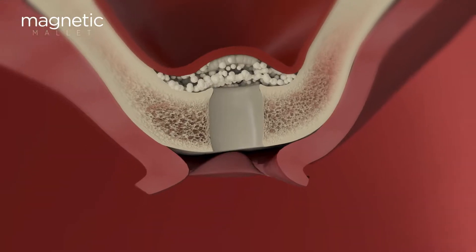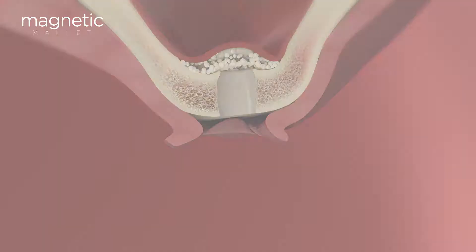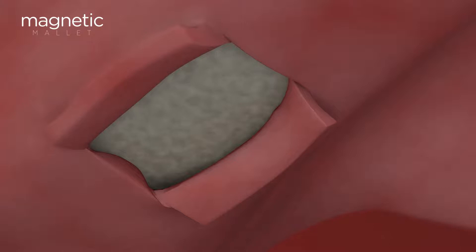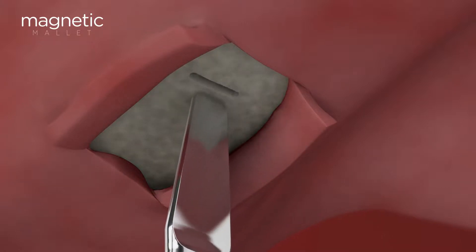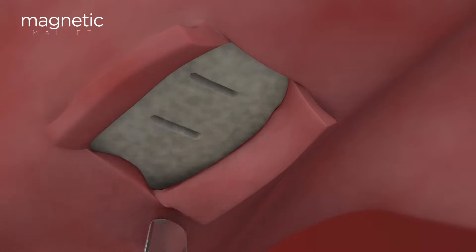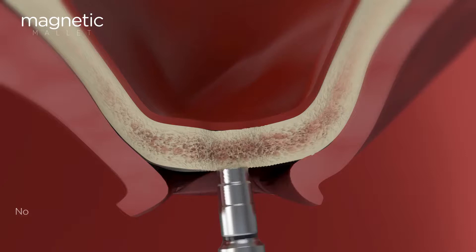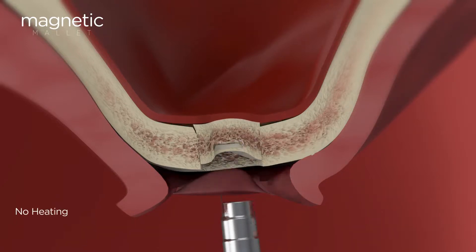The magnetic mallet will allow you to perform precise plastic deformation of the tissues, elevating the membrane with total control and safety, and protecting 100% of the native bone. If you have very limited residual bone, you'll be able to create a bone block and progressively elevate the membrane using the same level of control and safety. You'll experience no risk of tearing as you might with rotating or cutting instruments.